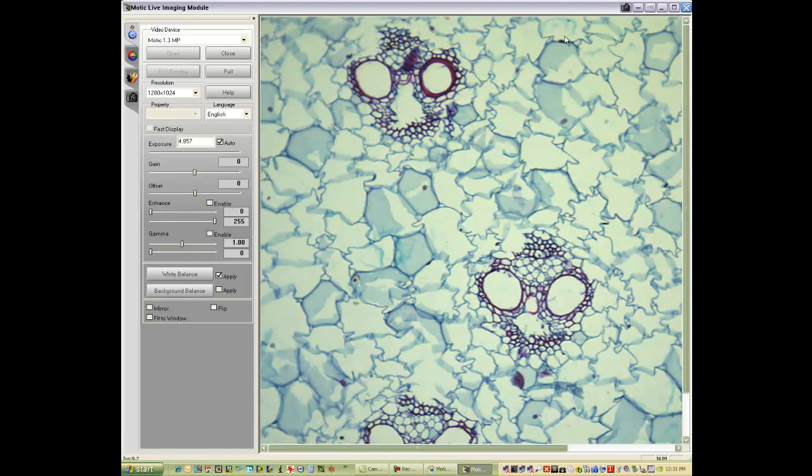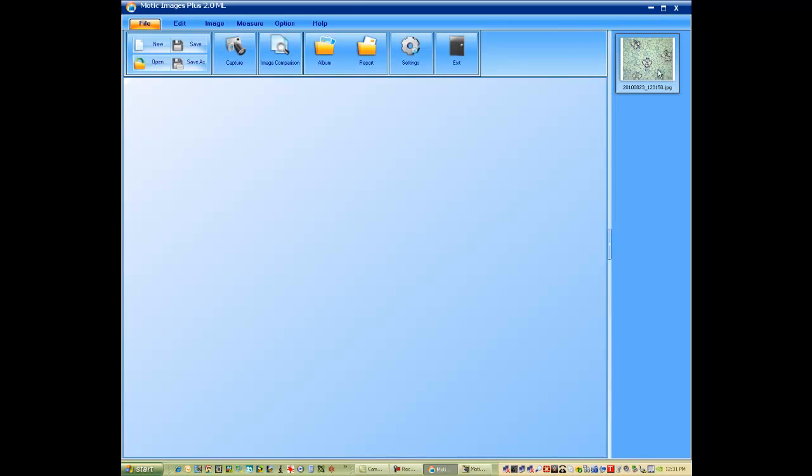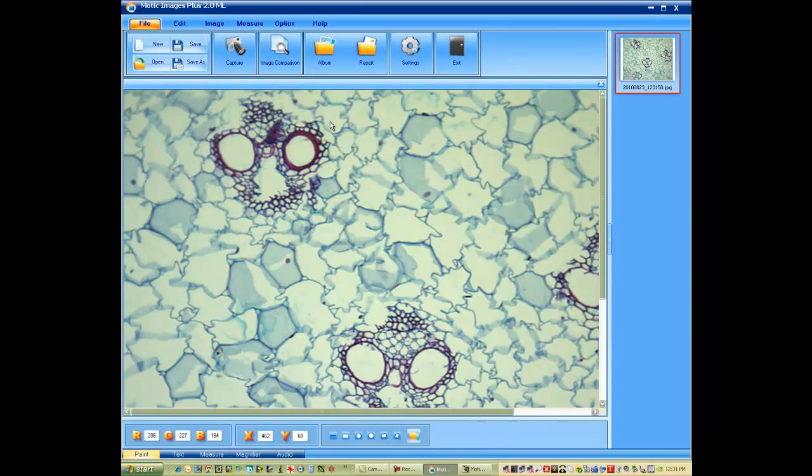We'd like to take a picture of this by simply clicking on the camera icon in the top right corner. This will take the picture in our Modic Live Imaging Module. Simply click on the image to activate it into the application software Modic Images.